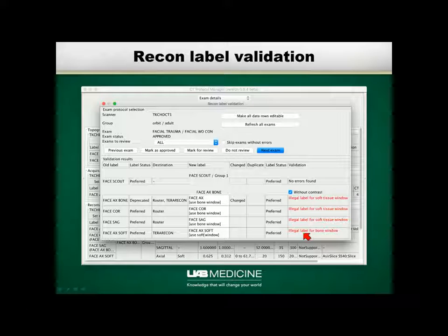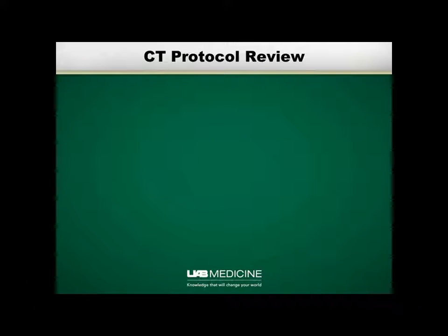So basically what happened was someone set that up improperly and then I copied this protocol and changed it to make the next protocol, and I copied that protocol, and this mistake propagated down. And this has been on the scanner for several years, and no one had noticed. I can assure you the radiologists were swearing under their breath as they were having to play with the window and level settings at the diagnostic workstations. But people never complain to the person that can actually do something about their problem.